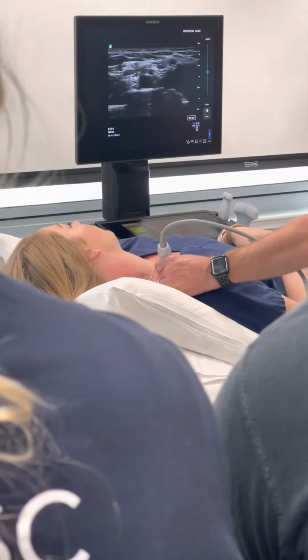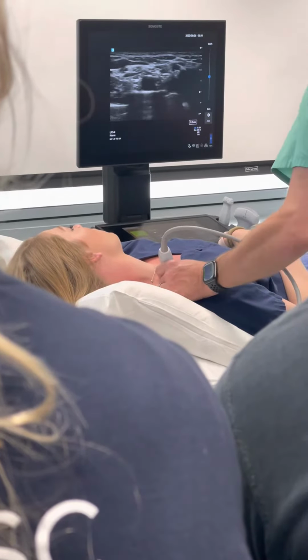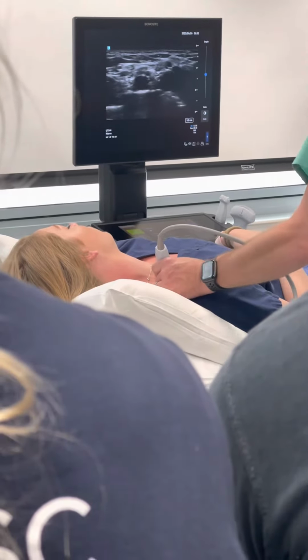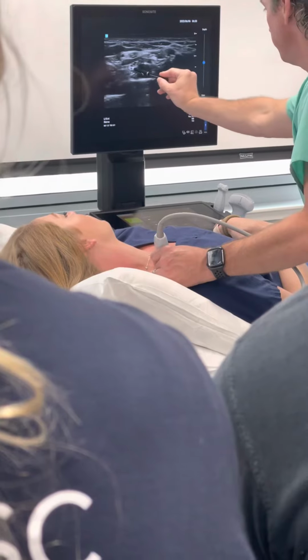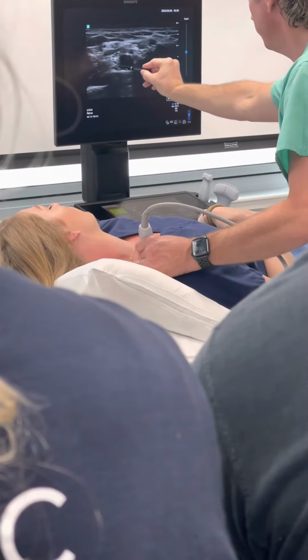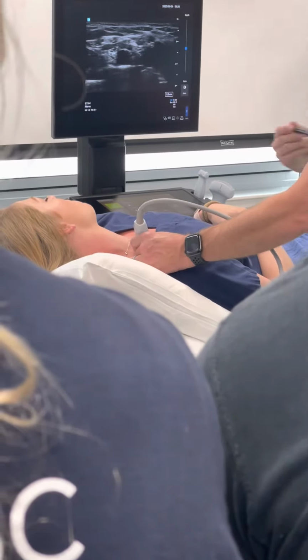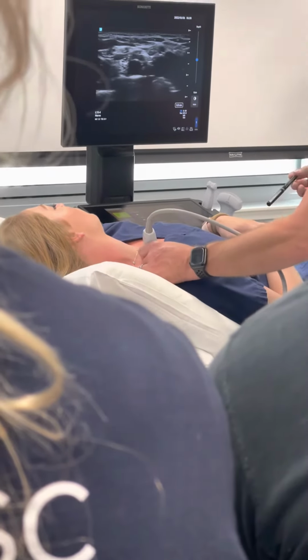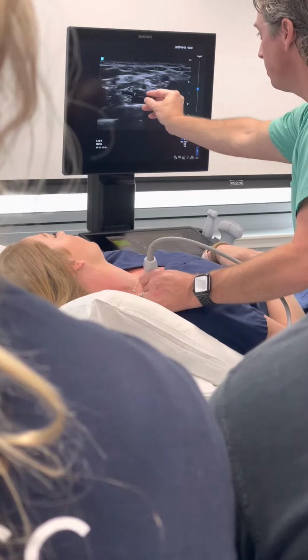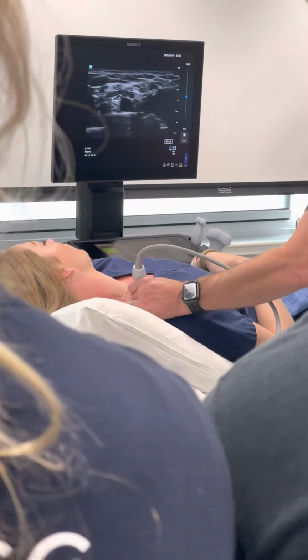All right, so now when we bring our midfield up just a little bit, all of a sudden now we can actually see those little bundle of grapes kind of sitting right over here, these little round structures right here. That's your brachial plexus that's sitting over there. When we're talking about the supraclavicular approach to the brachial plexus, the brachial plexus always sits kind of either lateral or superior lateral to the artery.